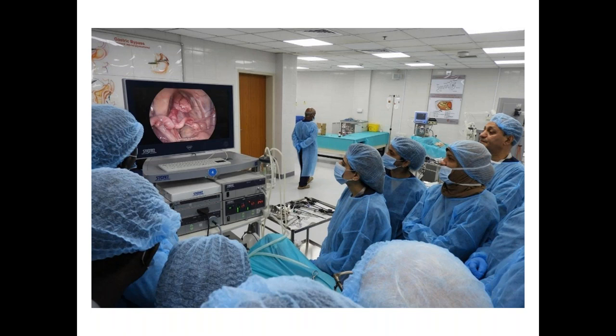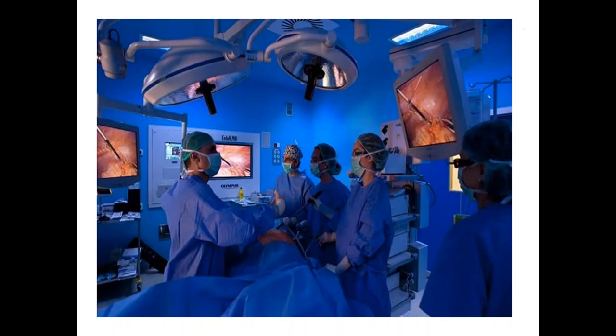So therefore, you're relying on gadgets in minimal invasive surgery, and everybody can see your surgery. It's very good for demonstration, for recording, and for seeing, and other people can even suggest. Your senior or experienced person can just look at the monitor and suggest, okay, do this, do that. So that's the beauty, or the usefulness, of minimal invasive surgery.